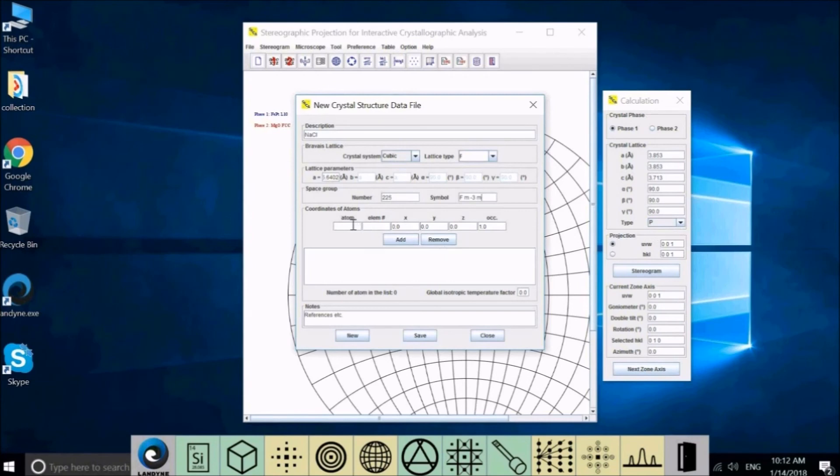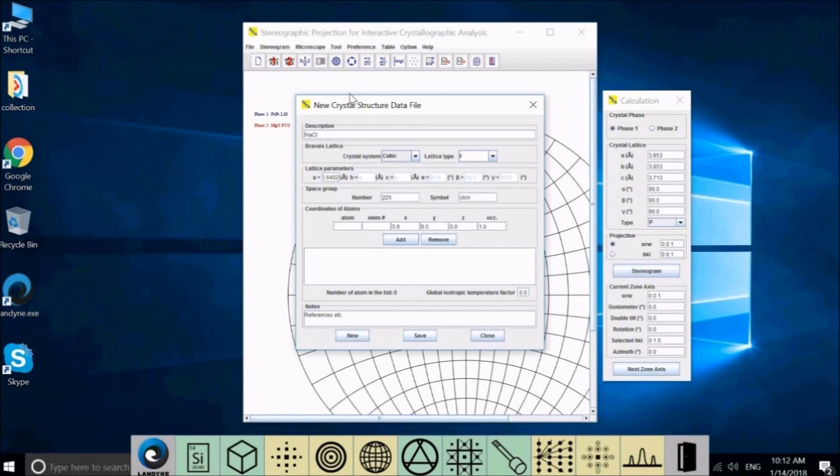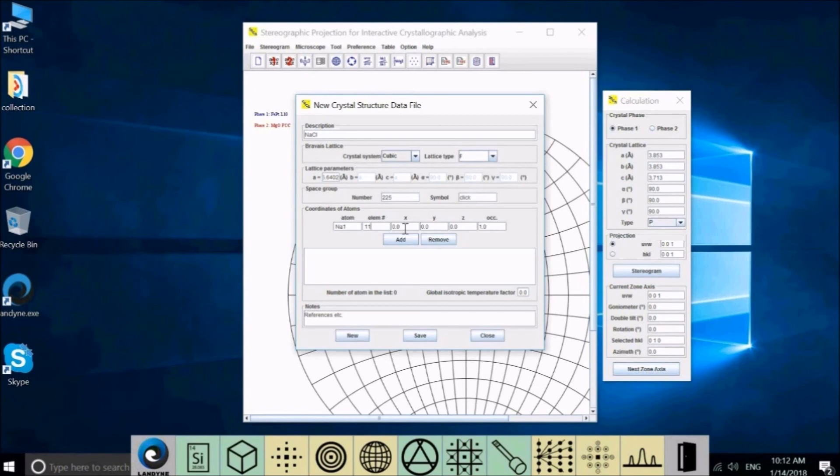There are two independent atoms in the structure. First one is sodium, Na1. Atom number is 11. Atom coordinate 0, 0, 0. Occupancy factor is 1. Add atom here.